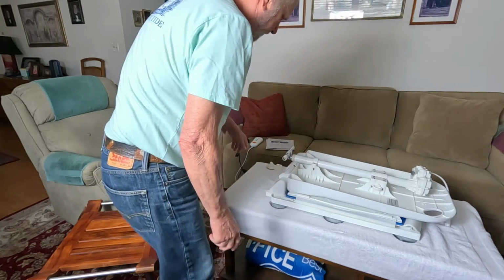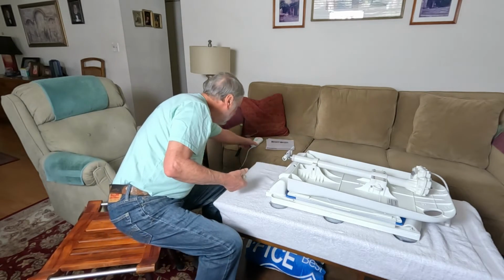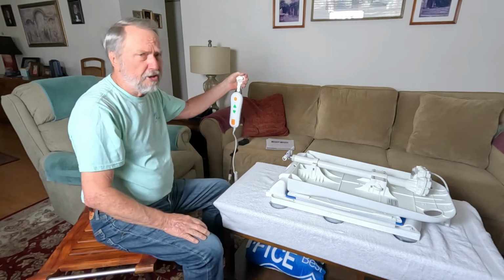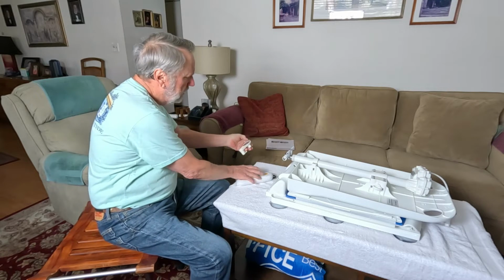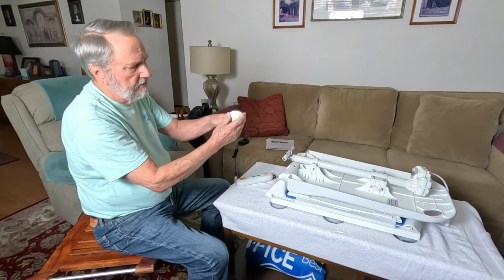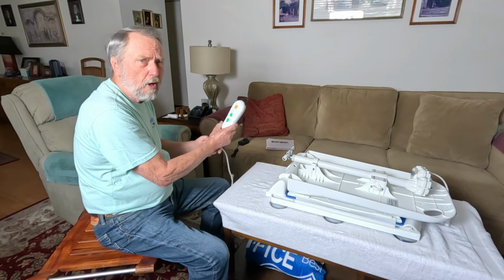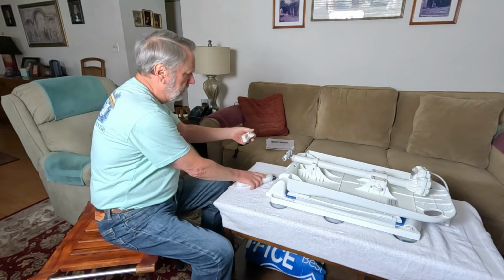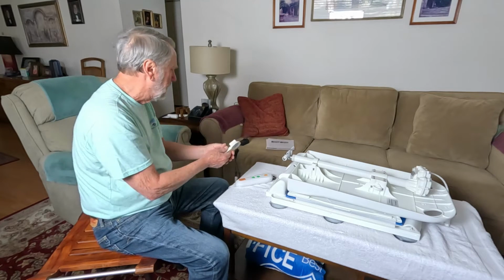But before I do, I've got one other thing. This is going to hold the remote control where the bathtub is. You have this little hook which has a suction cup on the back, and you crank this down and it pulls a real strong vacuum, because this does have some weight, so you want it strong enough that it can hold that, and this should do the job. And we'll mount this in the area where the tub is and demonstrate that.